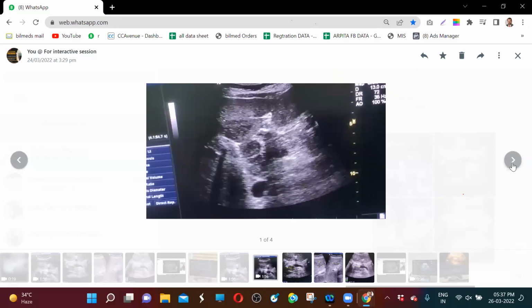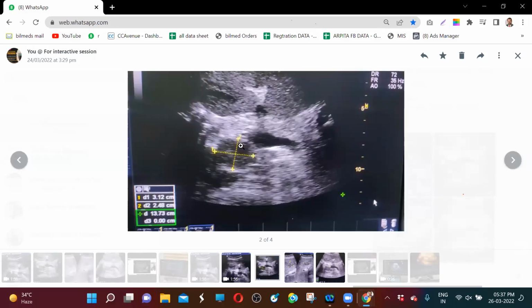Okay, anything else? Now this one. This can be, now see, a lymph node. But as this is adjacent to the pancreatic head, I have to think on lines of some suspected area. You know what I am talking of from the pancreatic head. Yes, sir.